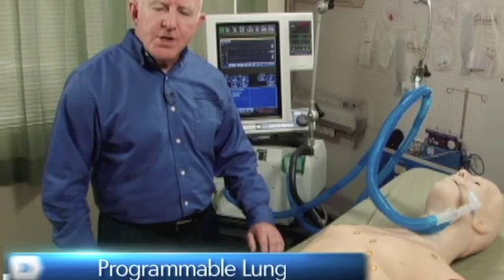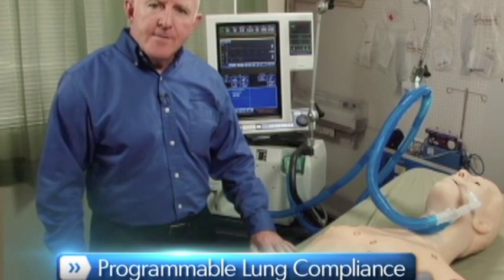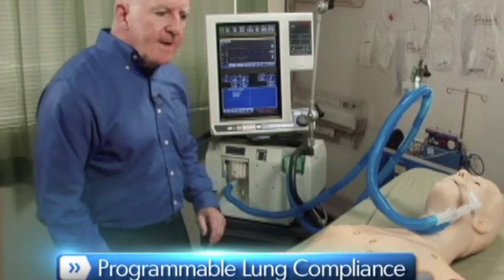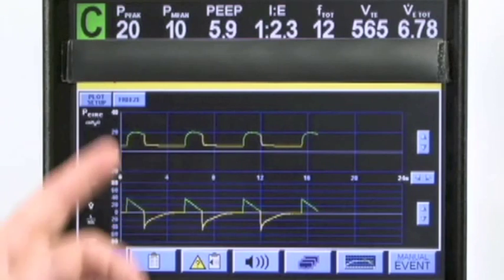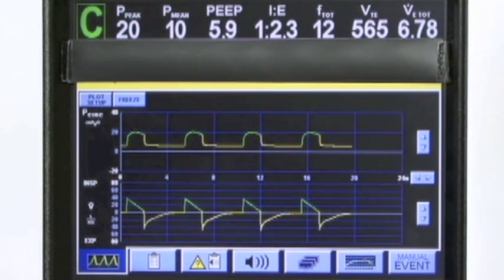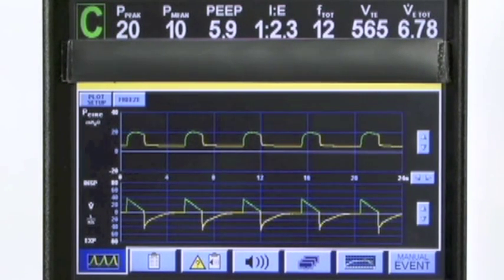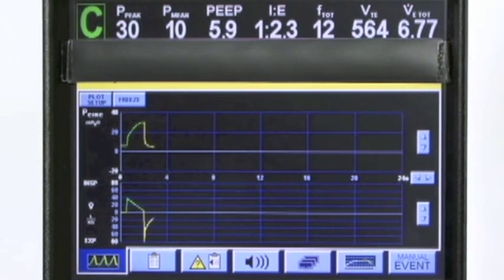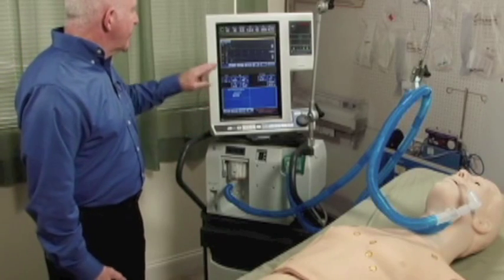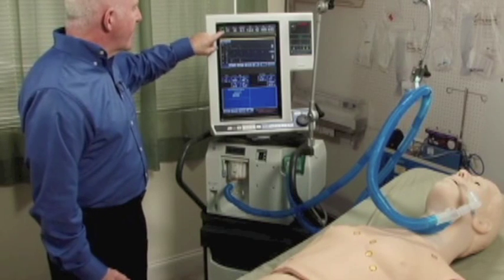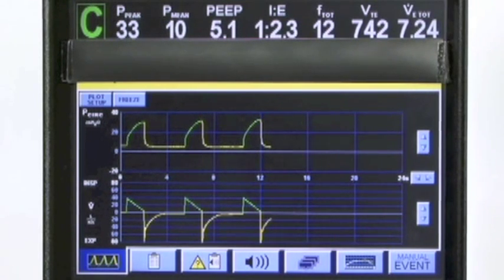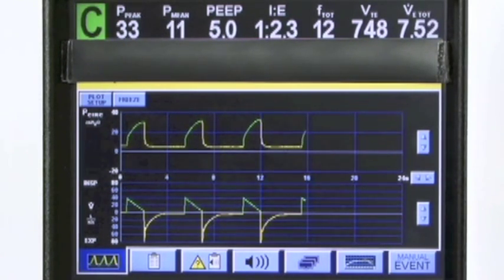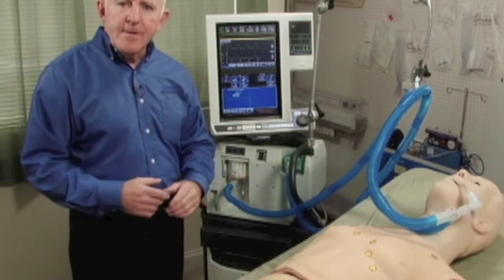HAL's lung compliance can be set from normal to very stiff or very loose. We presently see HAL on a setting of PEEP of 5, peak pressures of 20, with a set tidal volume in assist control mode of 550. If we make the compliance very low or make the system very stiff, we'll notice an increase in the relative parameters — a peak pressure of 31, 33. All this is being done while the mannequin is still operating in full scenario mode.